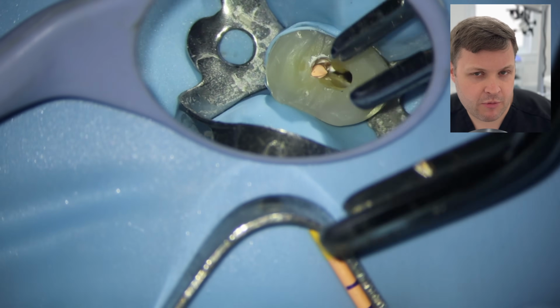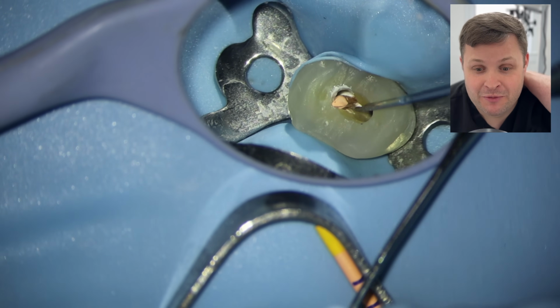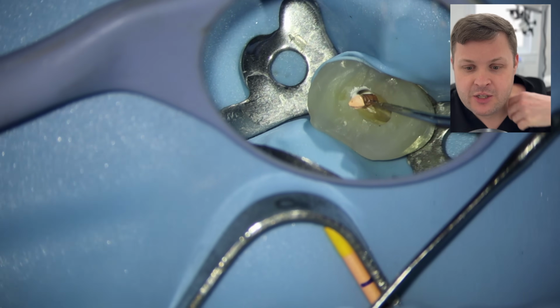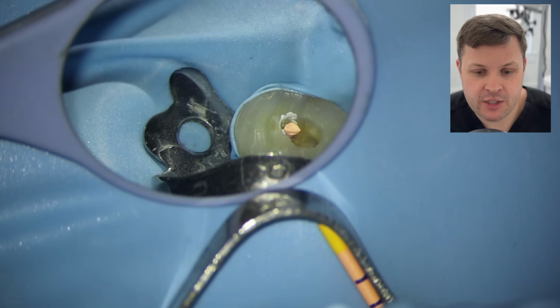Is there something wrong with the cone? And what I've realised is that I've picked up the wrong cone for the wrong canal. So this is actually the Palatal GP cone. So I am going to very, very carefully and quickly remove this GP cone.